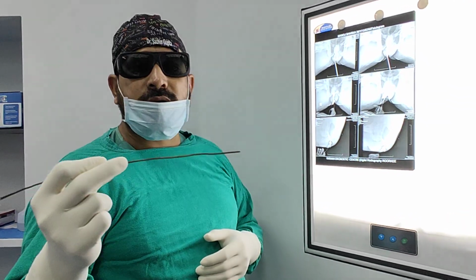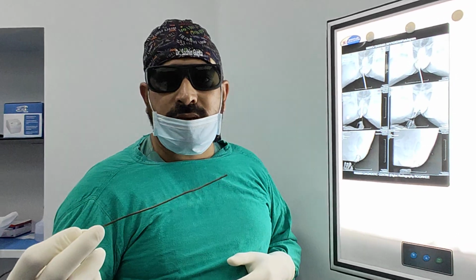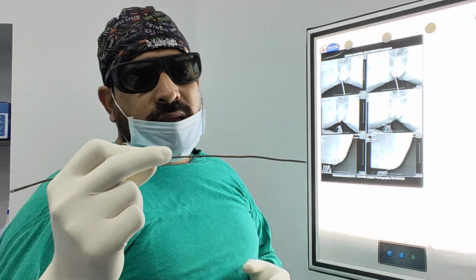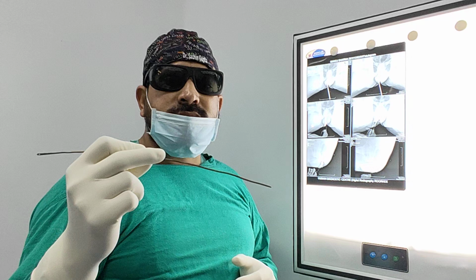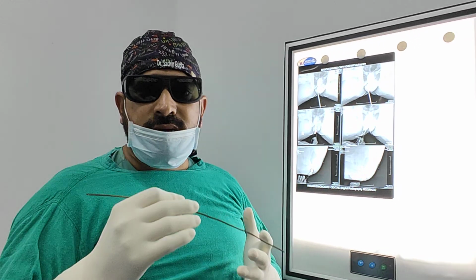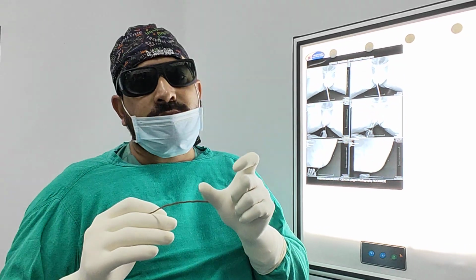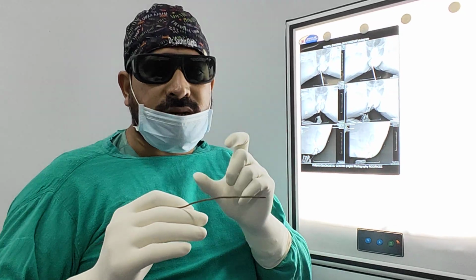This is nothing but a modified technique of LIFT that I am using. LIFT is basically different from this technique, because in the LIFT technique we have to ligate both branches, but I do not ligate first. First I do the DLPL followed by dissection, because with DLPL there is a narrowing of the cavity, and when I approach through the intersphincteric space, the tract is very clear, and the anatomy of the sphincter is very clear there.